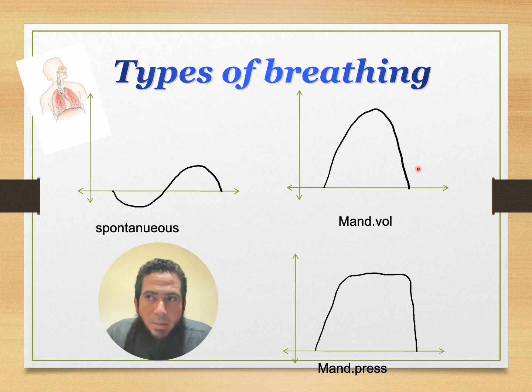For example, if we made the maximum peak pressure 40, and due to stiff lung, to deliver 500 milliliters of air the resultant pressure will be 55, the pop-off valve will open and the pressure will stop at 40, but the volume delivered will be less than 500. So you can determine the volume given to the patient, but you can put an upper limit of the pressure that it can reach, just to avoid any barotrauma or volutrauma.